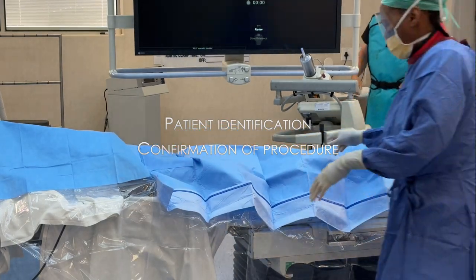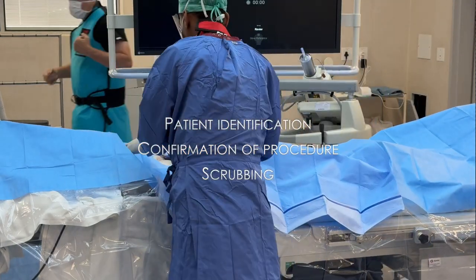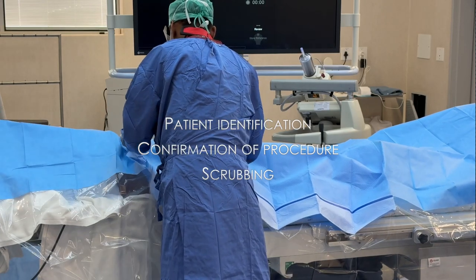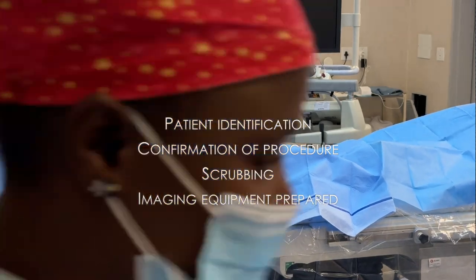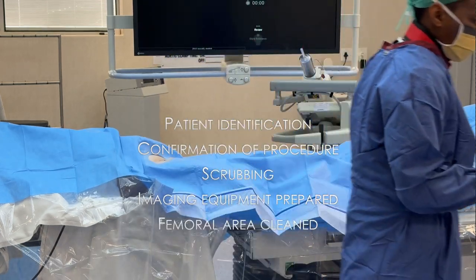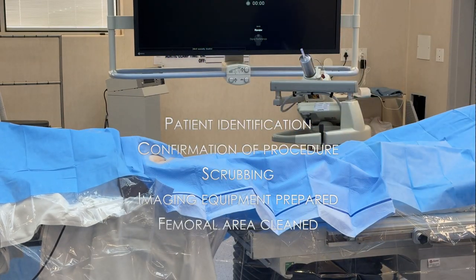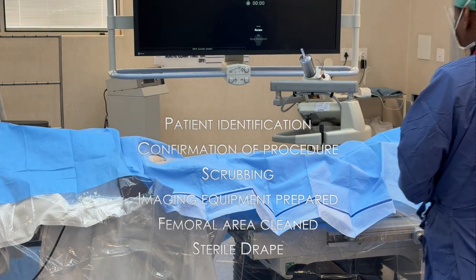While the surgeon and the theater nurse scrub for the procedure, the radiographer prepares the imaging equipment. The femoral area is cleaned and a sterile drape is placed.